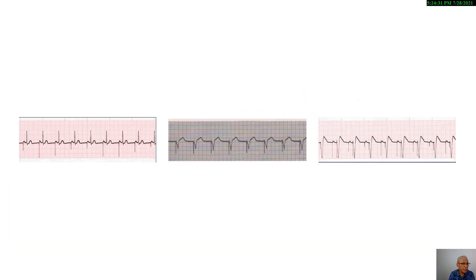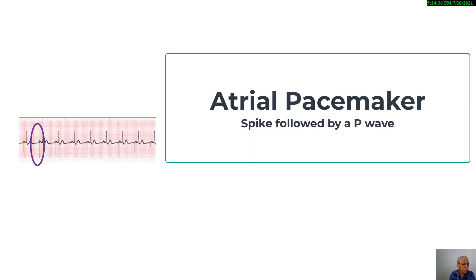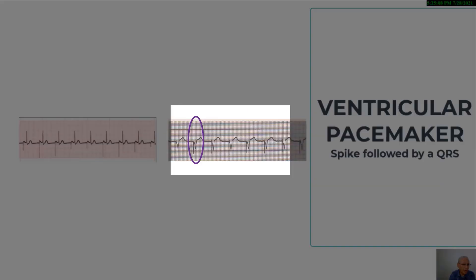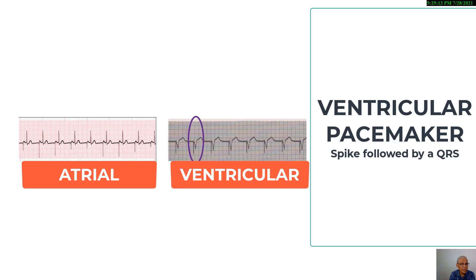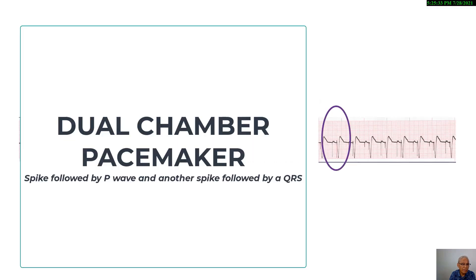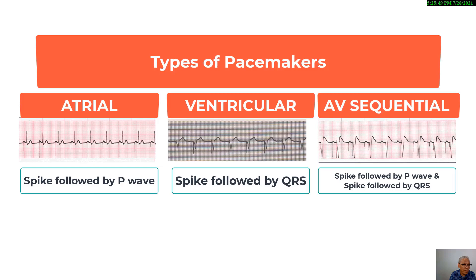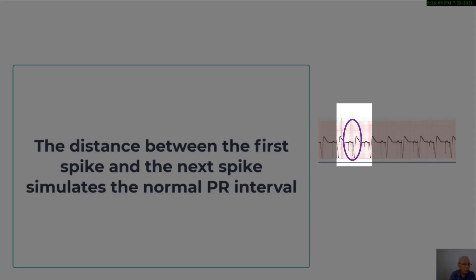The following are examples of pacemaker-initiated beats. The first is a pacing spike followed by a P-wave — an atrial pacemaker, a single chamber pacemaker with pacing and sensing leads in the atrium. The second is a pacing spike followed by a QRS complex, indicating a single chamber ventricular pacemaker. The third is a pacing spike followed by a P-wave and another pacing spike followed by a QRS complex, indicating a dual chamber or AV sequential pacemaker. The distance between the atrial spike and the ventricular spike mimics the normal PR interval.